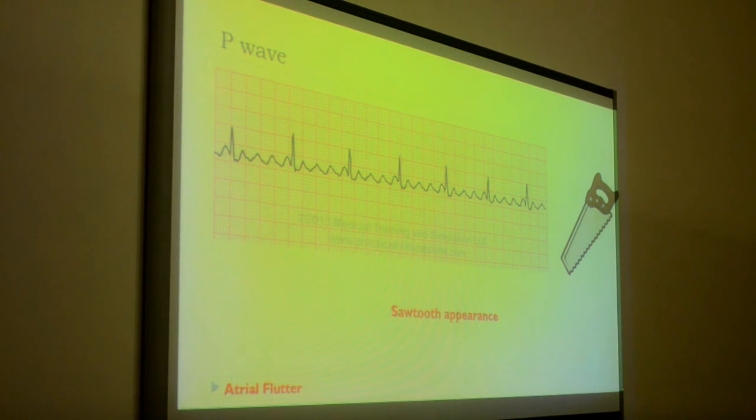Clear? You're right. Normally, these patients will present with tachycardia, 150 beats per minute usually. You slow down the AV node. There's a drug called adenosine, and you will have a whole lecture on supraventricular tachycardias. This is a drug that blocks the AV node, it doesn't completely block it, it slows it down a lot though, for about 10 to 15 seconds. If a patient comes with very fast, 150 beats per minute, you give them adenosine. This is the pattern that you get, atrial flutter. Basically, you want to spread the QRS complexes apart so you can clearly see the P wave. But you're right, normally it won't look like this, it'll be very fast.